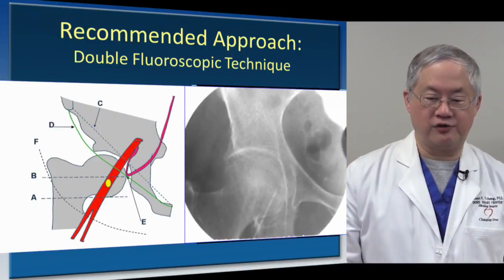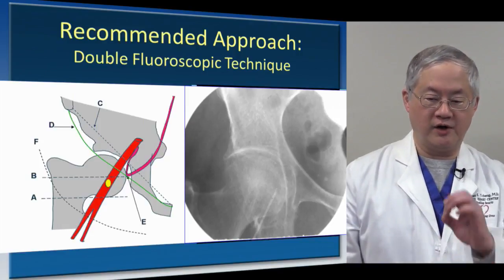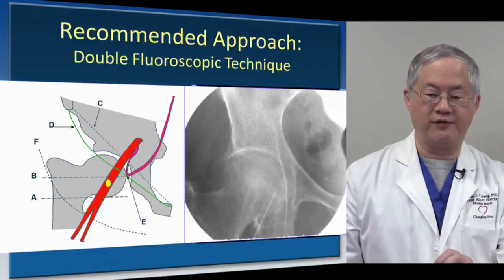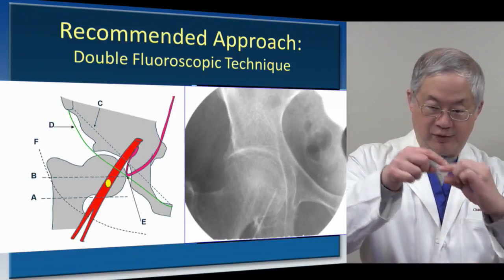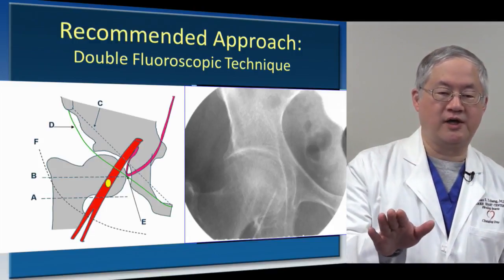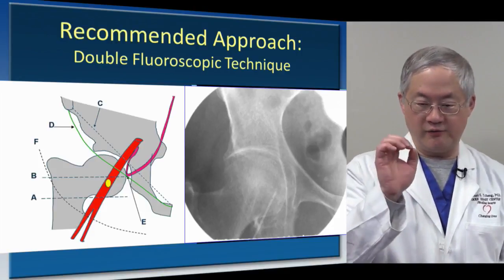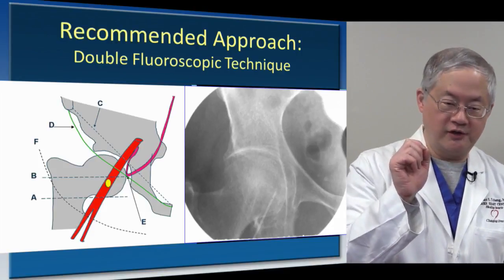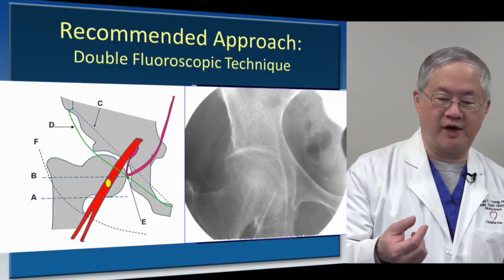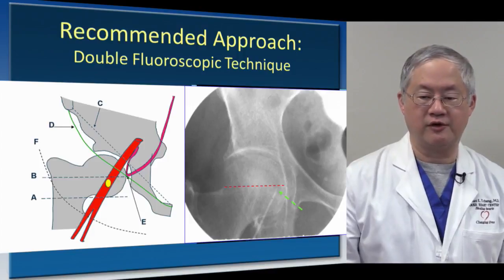Then, as you're introducing the needle, the second time you turn the fluoroscopy on is when you are right at the top of the vessel. You can actually feel it pulsating back at you. You know you're right there, and just hit the fluoro again to make sure that that's the spot that you want to hit. And then once you're there, use a kind of strike motion, advance the needle about 4 or 5 millimeters, and you should be right in the middle of the femoral artery.